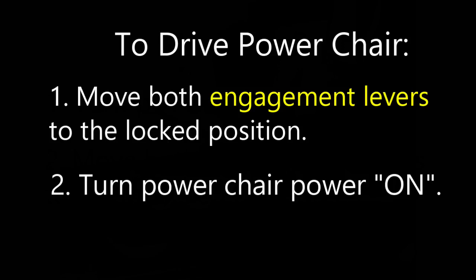Please be cautious and be aware that if you are going down a ramp with the drive motors disengaged, your PowerChair will freewheel on the declined surface.